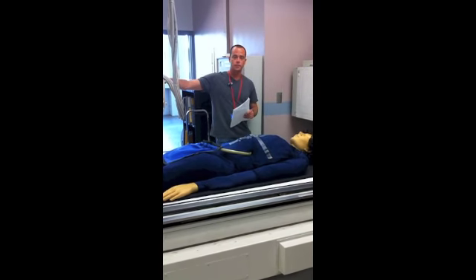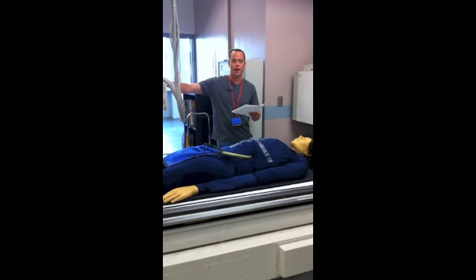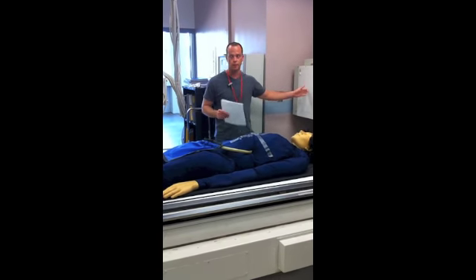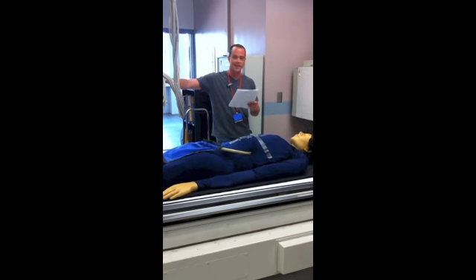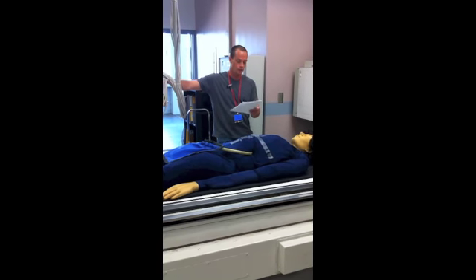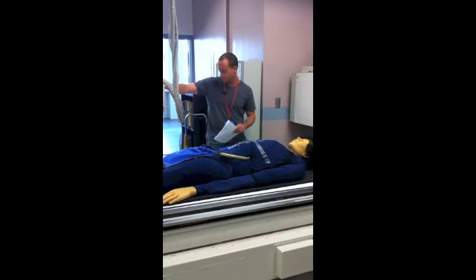For chest, I like to double the mAs and add 5 to the kVp for lateral chest because it has a lot more body to go through. So for homeboy here, with PA chest was 110 and 8, so we're going to do 115 kVp and 16 mAs. And like the PA chest, the exposure is taken at full inspiration.